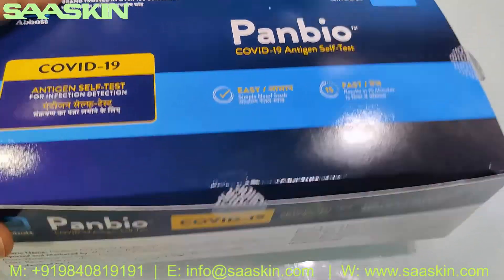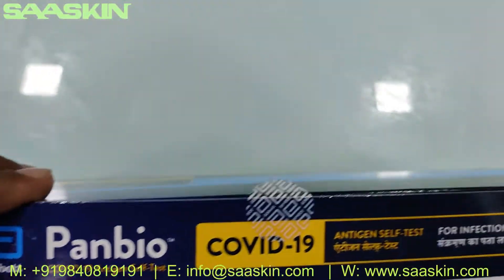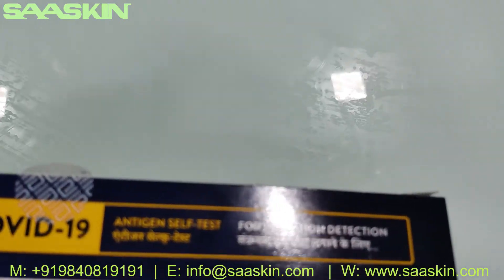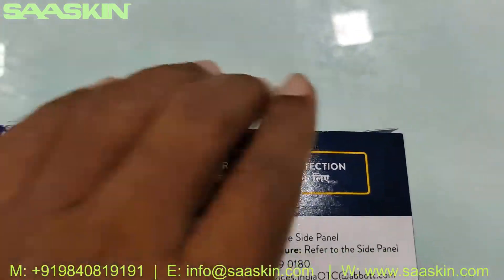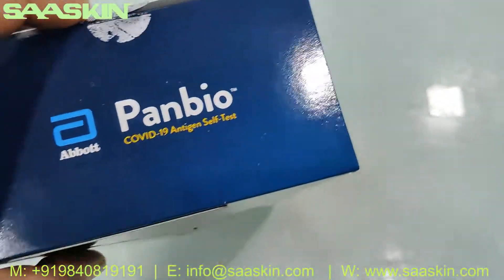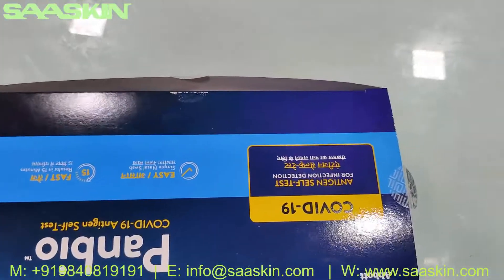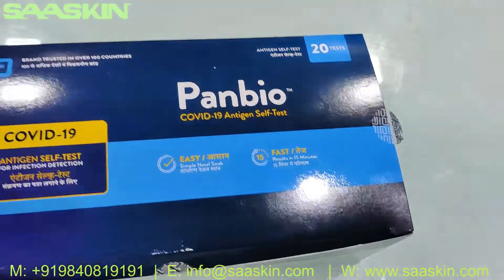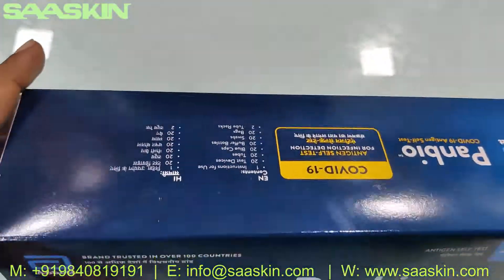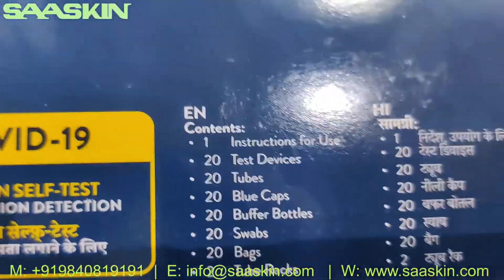Let me go through the box completely. This is what the box looks like, and it also talks about the key contents inside.